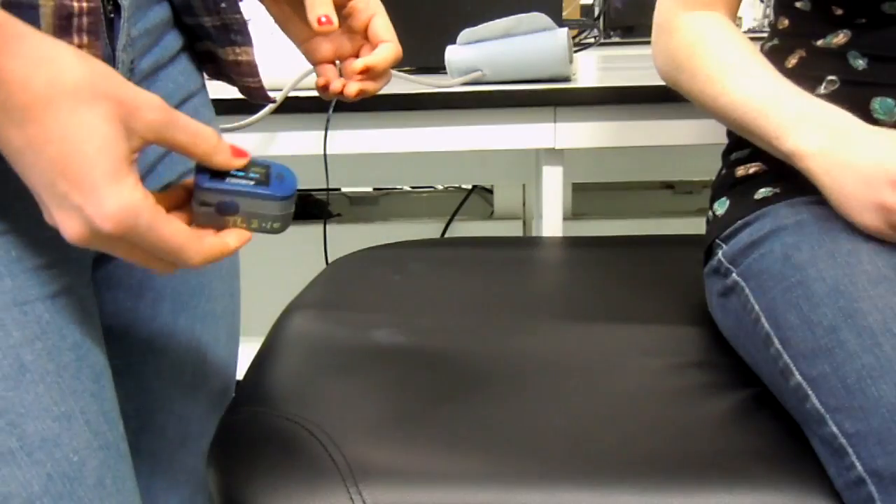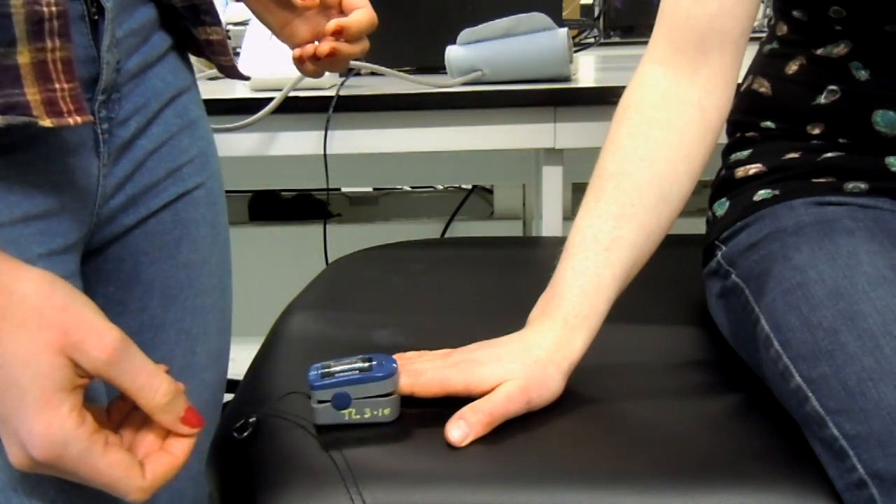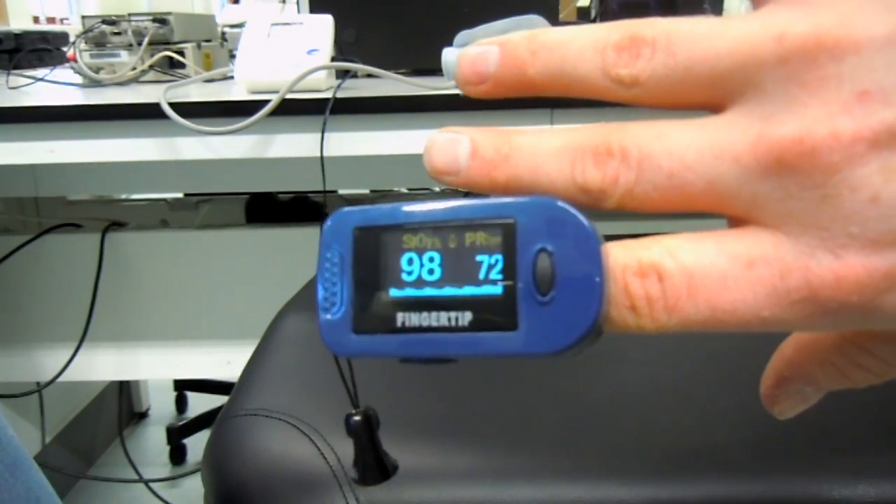First things first, heart rate. Rachel's going to be our subject. All you do is get your index finger, pop it in, and you'll get your oxygen saturation levels and your heart rate.